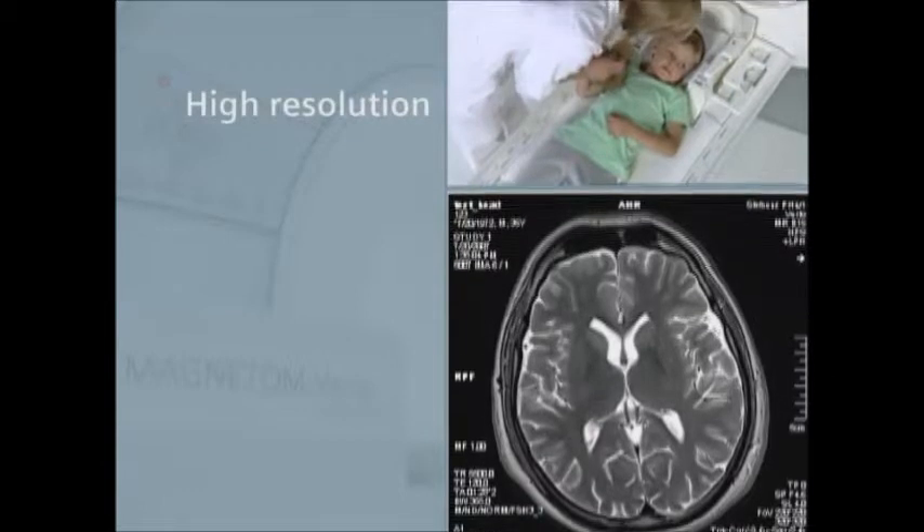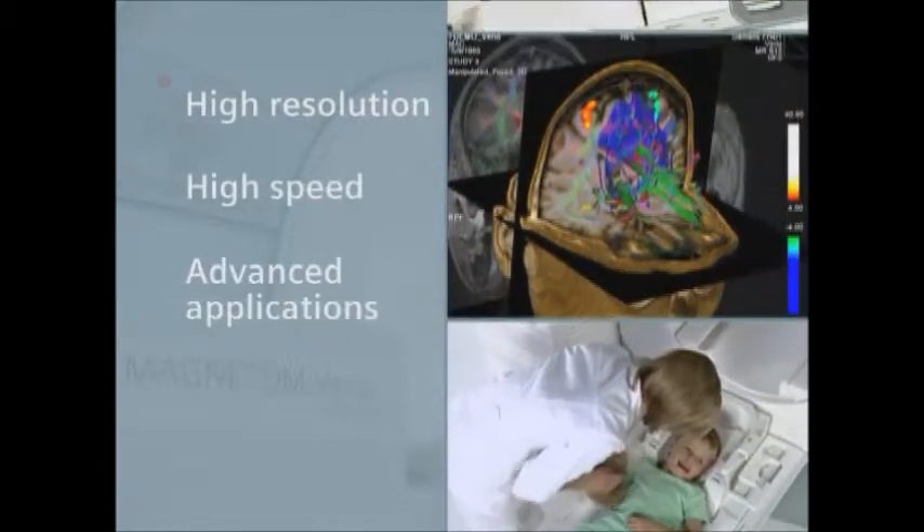Magnetom Vario helps deliver all the benefits of 3T field strength — high resolution and speed needed to support advanced applications.